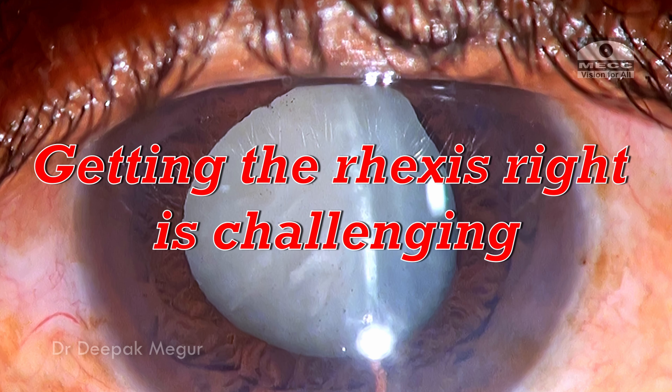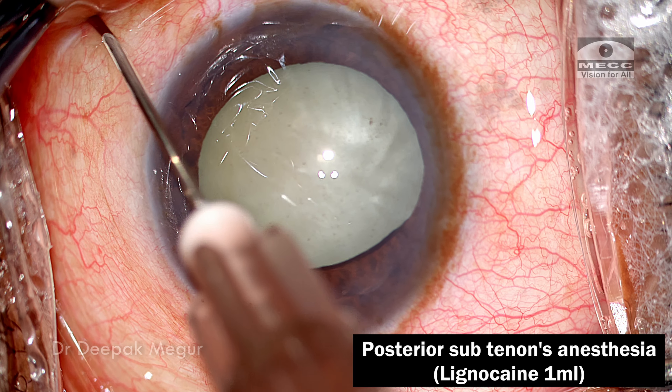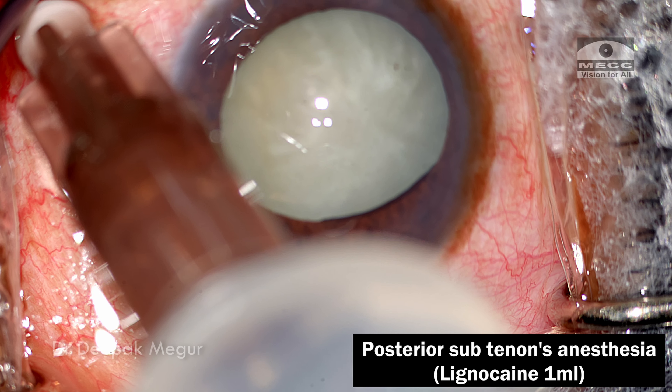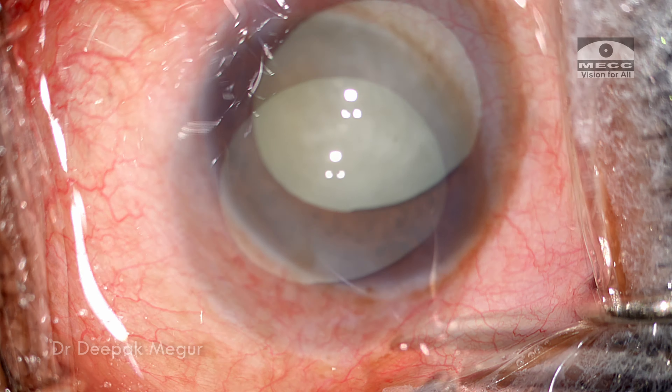The surgery is being done under posterior sub-Tenon's anesthesia. I'm injecting about 1 ml of lignocaine into the posterior sub-Tenon's space in the inferomedial quadrant.